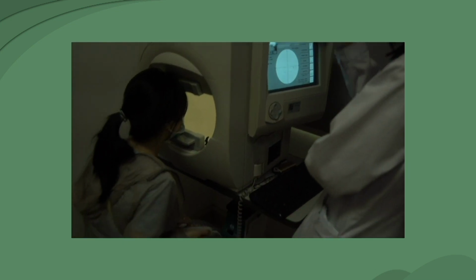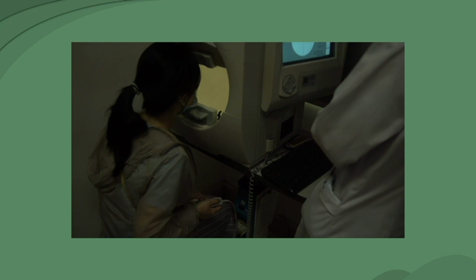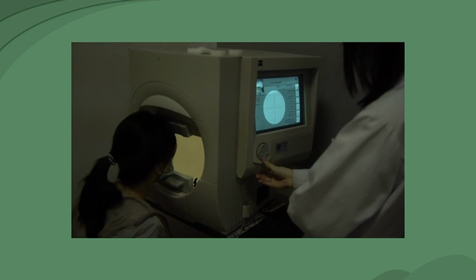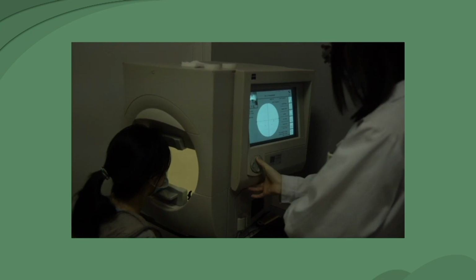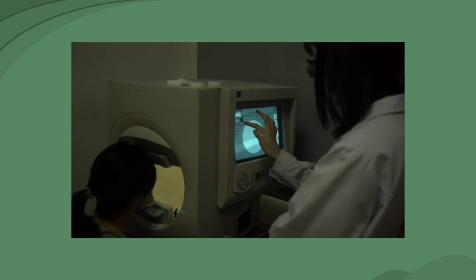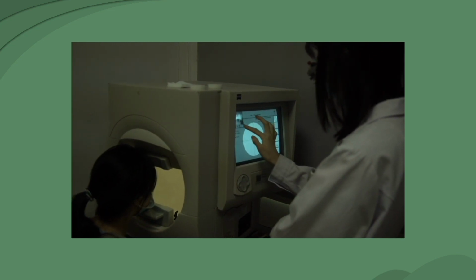It is more accurate to check the visual field with a perimetry machine. As the patient's eye fixates on a central target, test objects, flashes of light, are randomly presented at different positions throughout the field. When the target appears, the patient responds with a handheld signaling device. Varying the target's size or brightness permits quantification of visual sensitivity of different areas in the field.